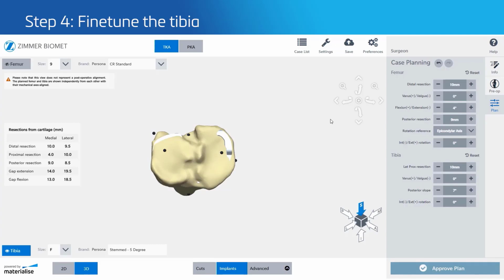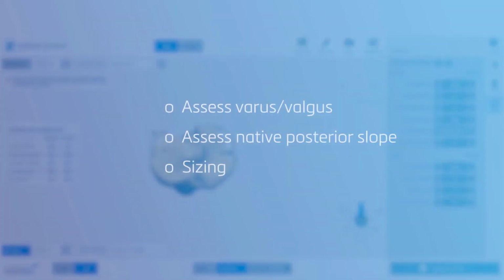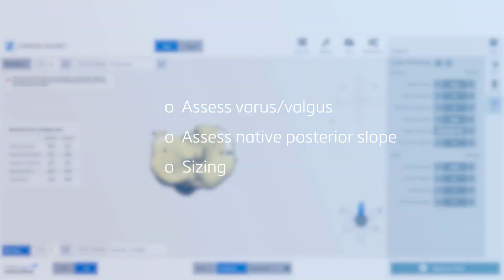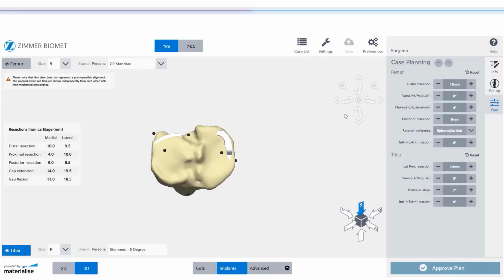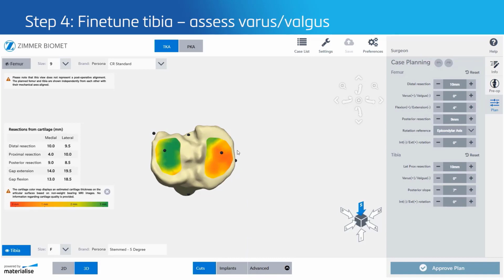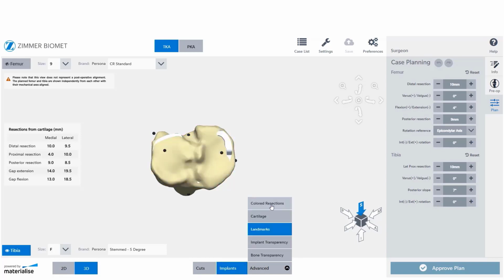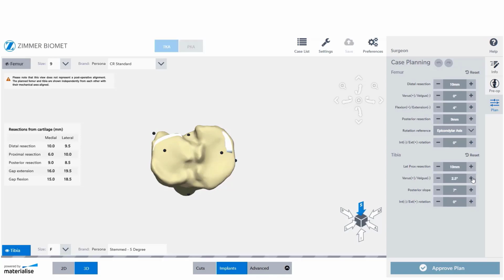Activate the tibia now to verify the tibia resection, implant size, and position. Follow these 3 actions to fine-tune the position of the tibia implant. You can first do a visual assessment of cartilage wear patterns. Adapt the varus-valgus angle in function of the patient's anatomy and your alignment philosophy. Note that this will impact the proximal resection levels.